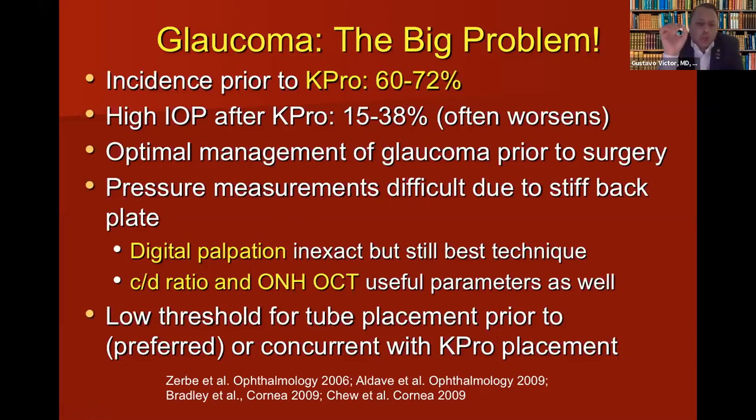Also, the tonometer can be used on the host cornea, at the limbus, something like that. You can try to measure the IOP in another part of the eye and compare it with a normal patient at the same place, and then you can manage the IOP in this kind of patient.